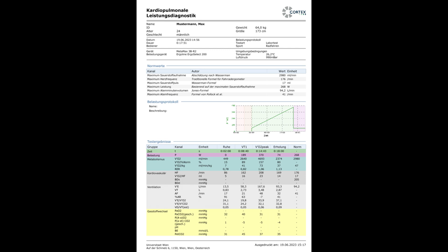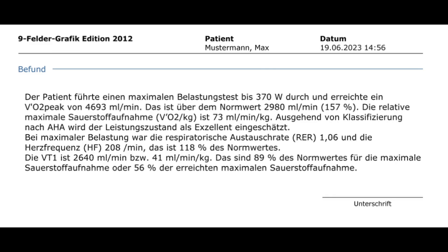On another page, detailed information on the various training areas is given, including a time-course graph. Also included is a written report with absolute and relative oxygen uptake, VO2 peak, respiratory exchange rate, maximum heart rate, and the ventilatory threshold one.